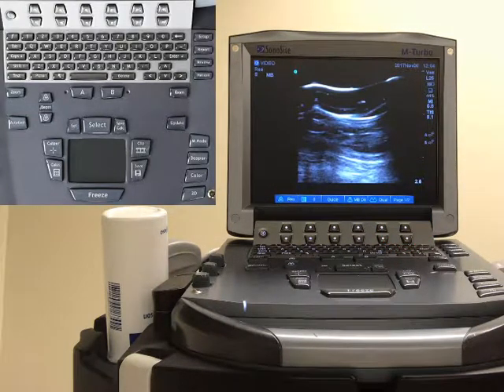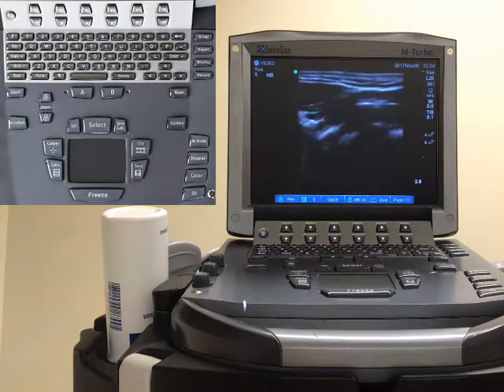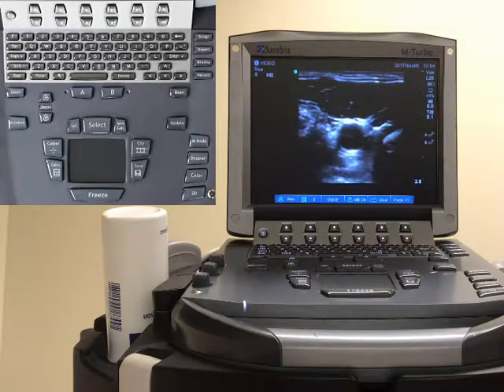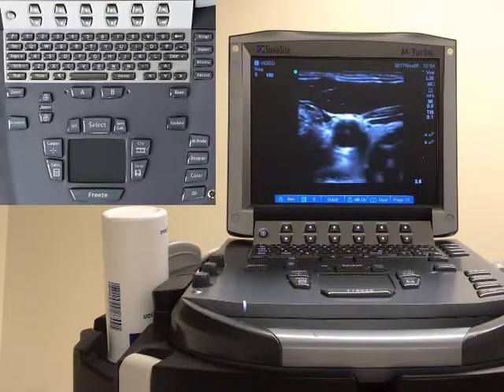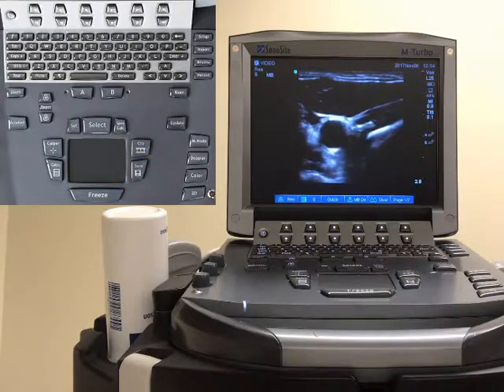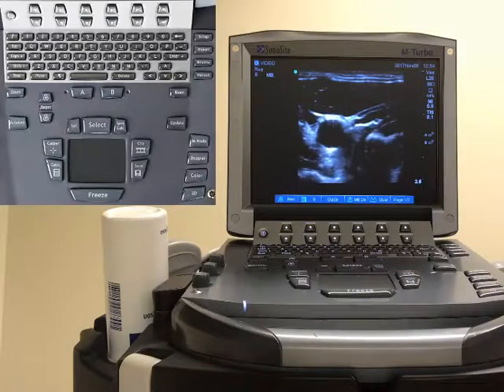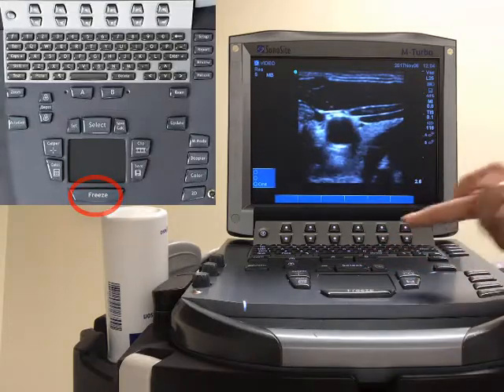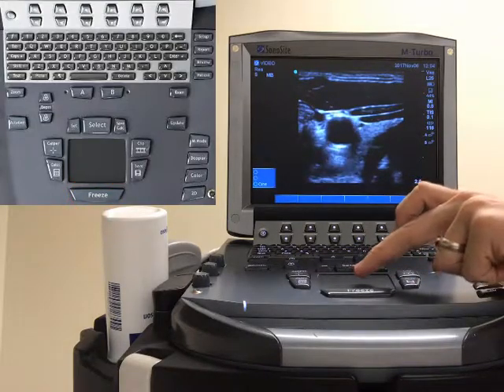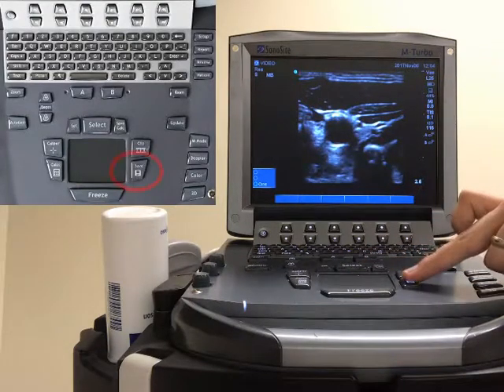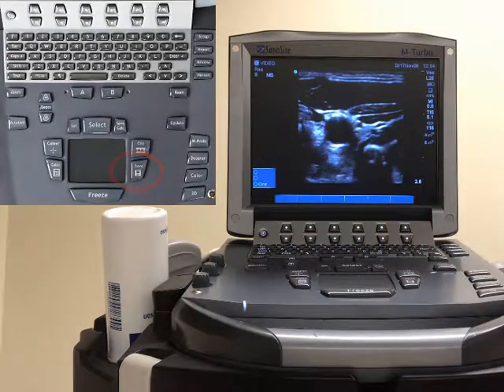Once you have the study you can take an image. When you have an image you like, you can press the save button. To better know which frame you are saving, you can push freeze. With the trackpad you can move forward or back to get the exact time you'd like to save, then simply push save again and you save that image.